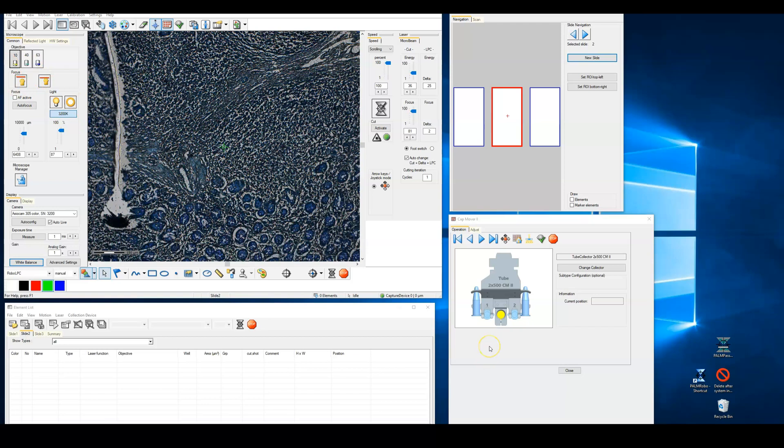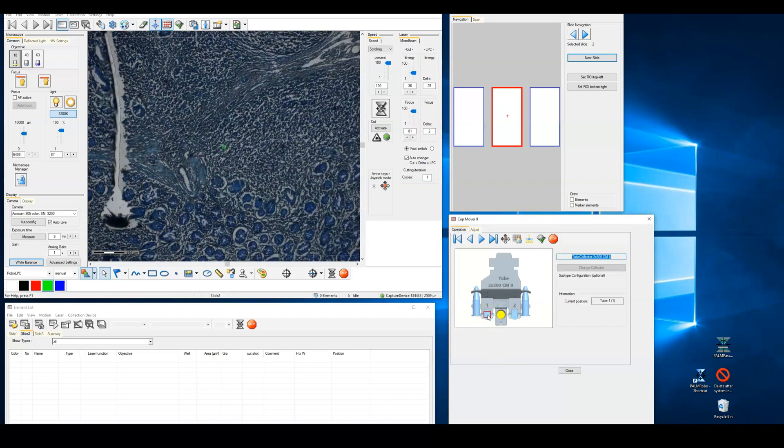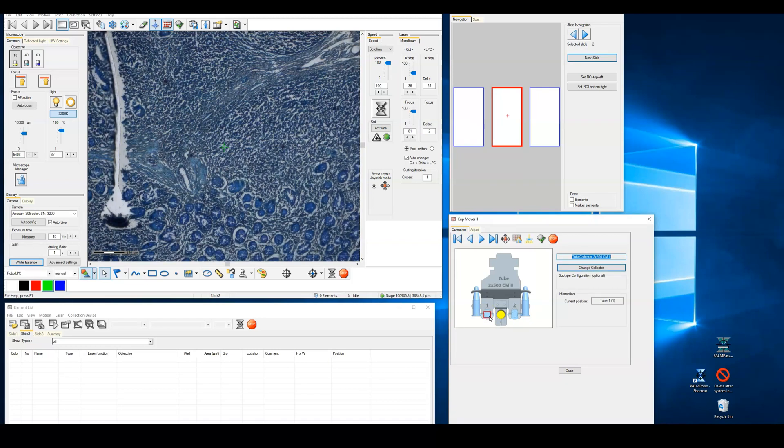Because laser capture micro dissection is often an entirely new experience, let's start with a simple demonstration of what you should expect when isolating tissue. I have a capture tube in place and we'll click on the graphic of that tube in the capture device control window. This will move the tube into place over the sample.